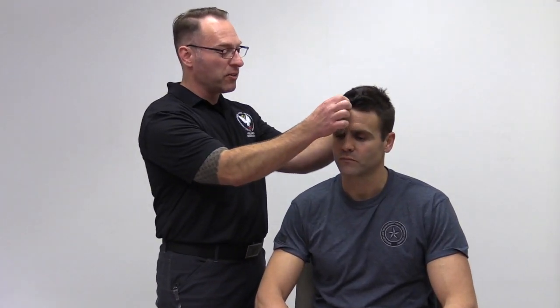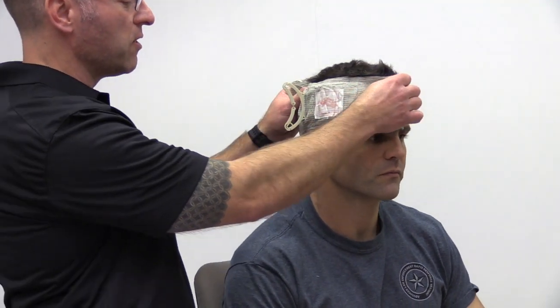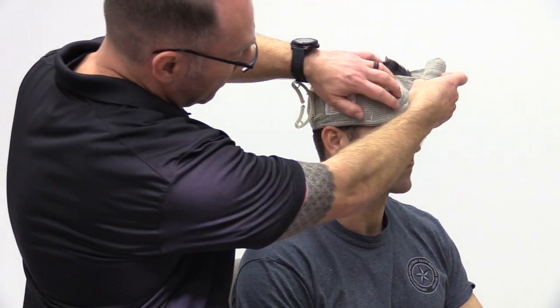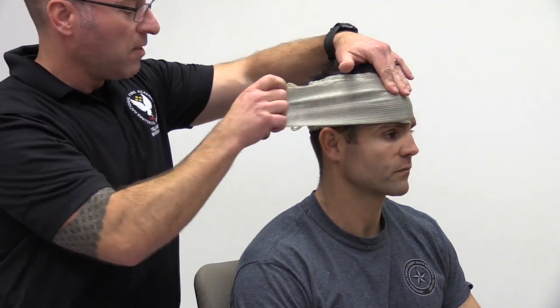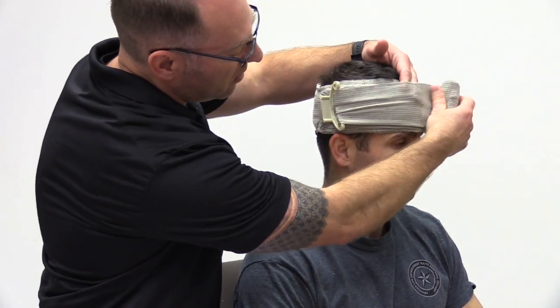And another application that we can use for the Israeli bandage, potentially if we have a head injury, this technique also works with the North American Rescue bandage. So I'm going to deploy my bandage, take the pad, and place it on the side of the injury. I'm going to turn you to your other direction, Dustin. There you go. That's good. I'm going to come around the head and try to avoid getting into the patient's eyes. Go through the pressure bar, reverse direction.